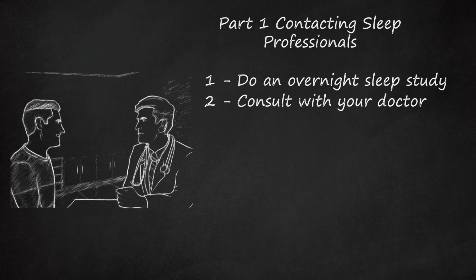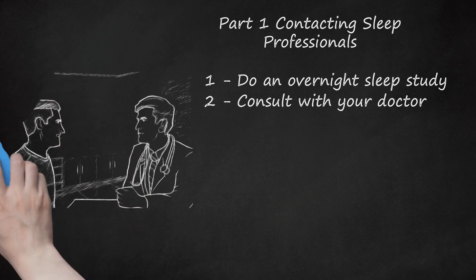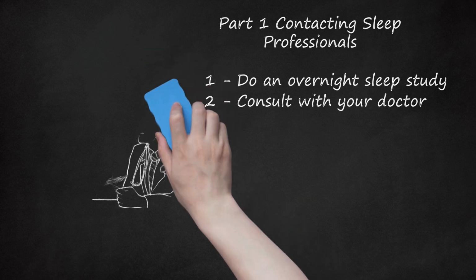If you think those initial settings need to be adjusted, you should contact your doctor or sleep clinic to have them checked. Adjustment of the air pressure settings may be necessary when you gain or lose weight, you are extra tired, you have had a few alcoholic drinks, you are on prescribed sedatives, you have sinus congestion, you are using a different mask, you are at a different altitude, you have jet lag, or you change stages in your sleep cycle.